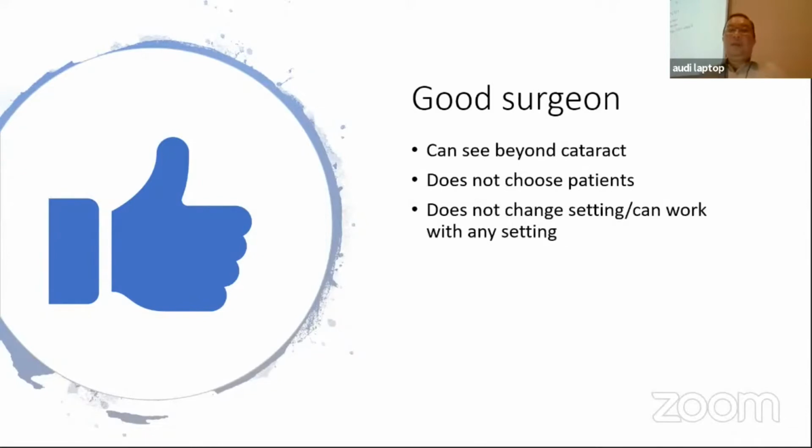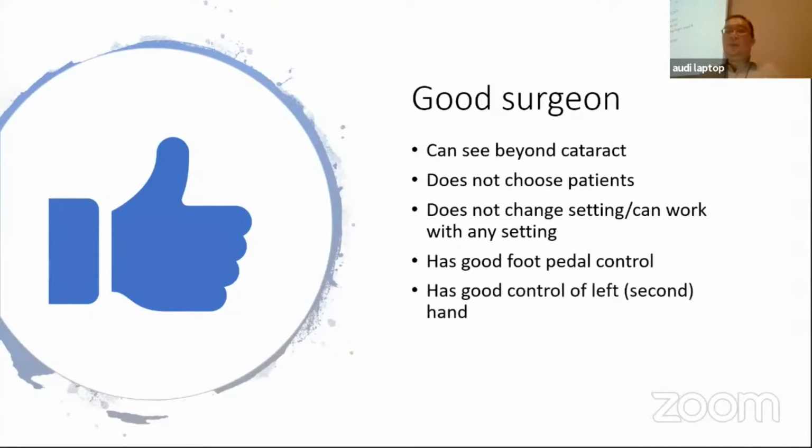And the way I do cataract surgeries, I don't change so much of the settings. My setting works only one. What works is your foot pedal control, most of the time, with the exception of high myopes. Sometimes I change, but most of the time I don't. And foot pedal control must be excellent. The idea of this is foot pedal control, left hand control. These two things, and you can do Phaco well.